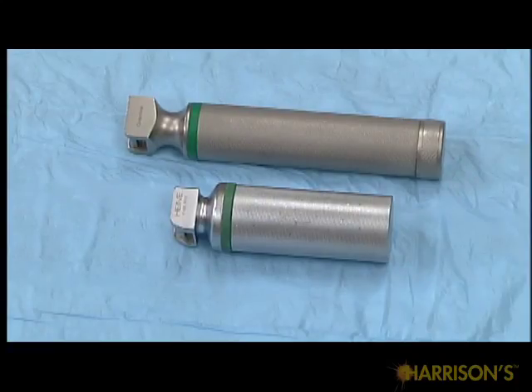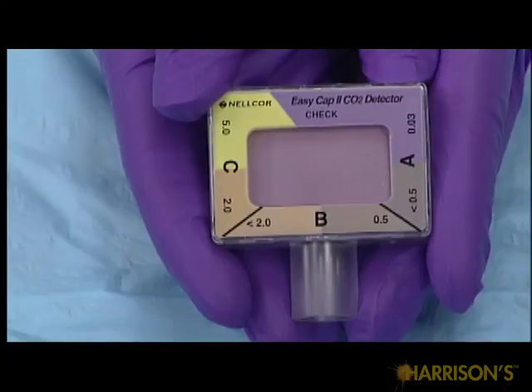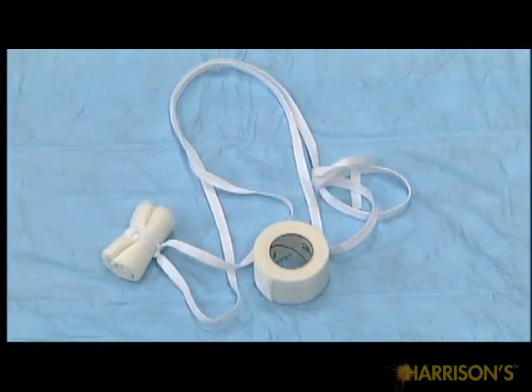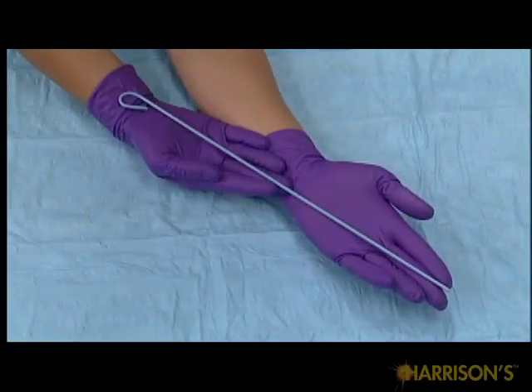laryngoscope handles, laryngoscope blades, a curved Macintosh and a straight Miller in various sizes, end-tidal CO2 detector, stethoscope, tie or tape for securing the tube, LMA in case of inability to ventilate or intubate, one size smaller and one size larger than presumed size, stylet.